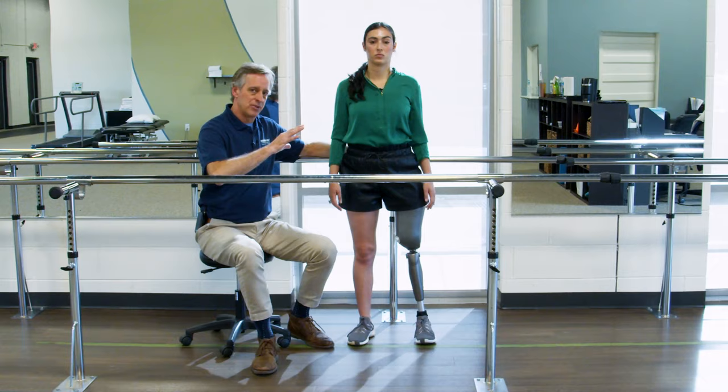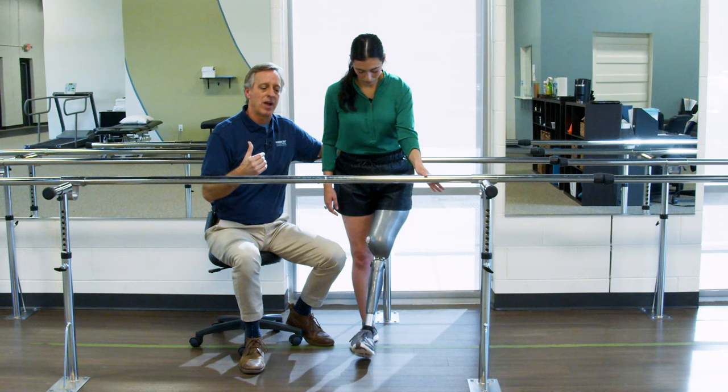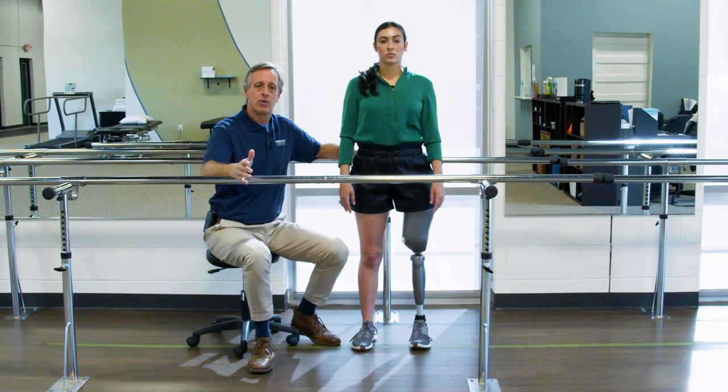Now, two things you may notice on camera, and she can feel, is that sidestepping away from the prosthetic is faster. She can really move quickly away from it. When she's sidestepping to it, it slows her down a little bit, and she has to work a little harder to get over it. Why is that so important? That's important if you're getting back to any kind of recreational sports kind of activities.